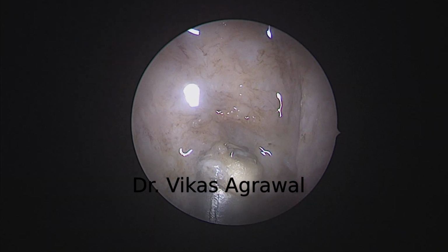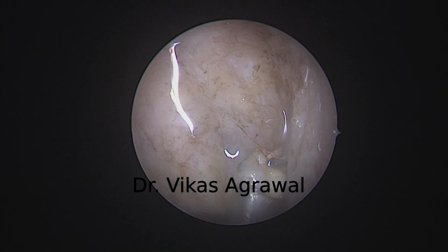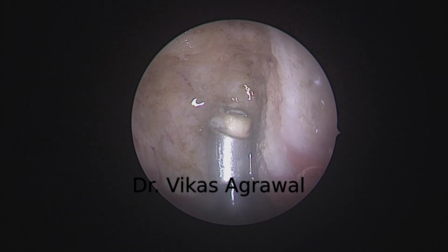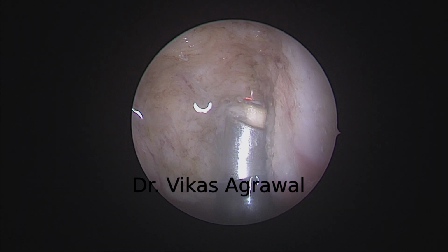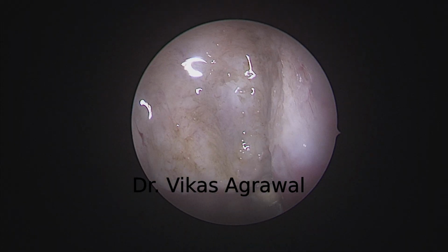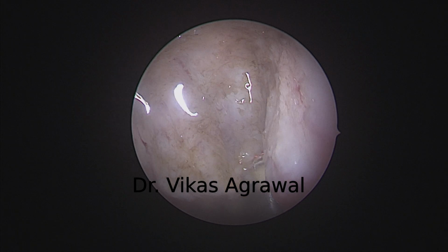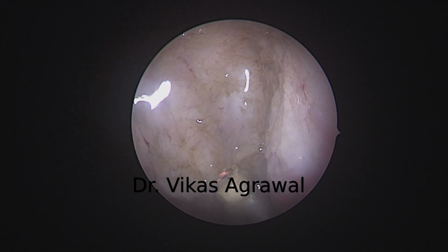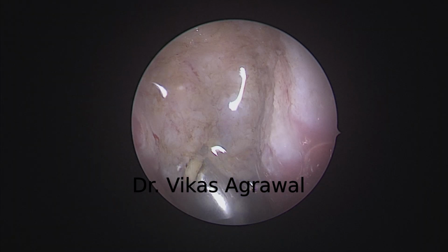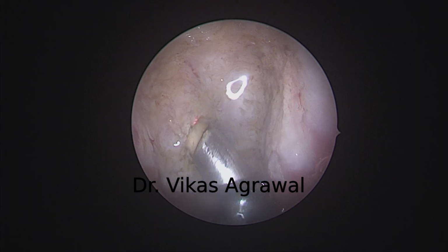You can see that's the buccopharyngeal fascia. I have removed all the lymphoid tissue, that's the fascia. Now you are seeing the fascia very, very clearly. You're not supposed to open up the fascia, only define it.